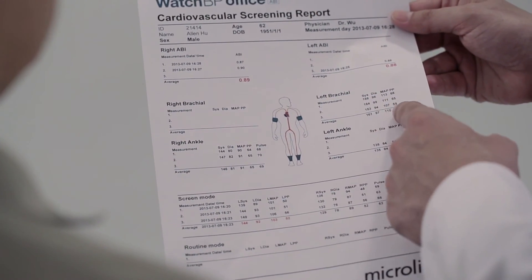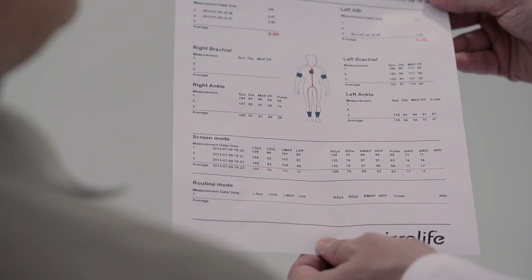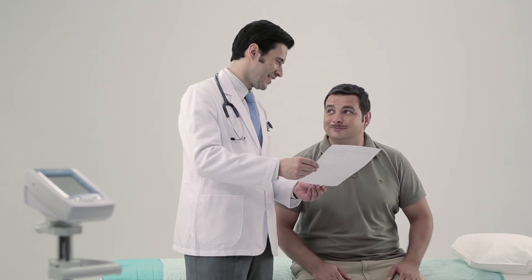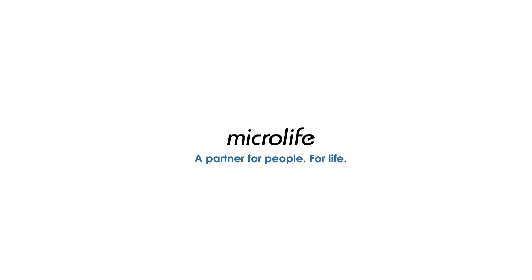A cardiovascular screening report will be generated automatically after the measurement. MicroLife Watch BP Office ABI is for fast, easy and accurate ankle brachial index assessment. MicroLife — a partner for people, for life.